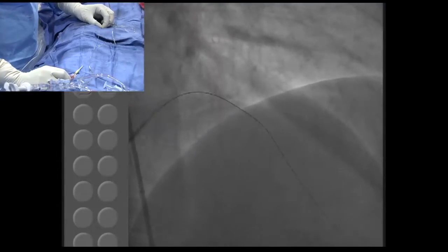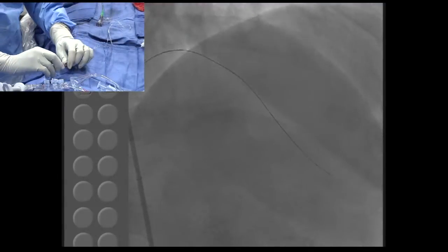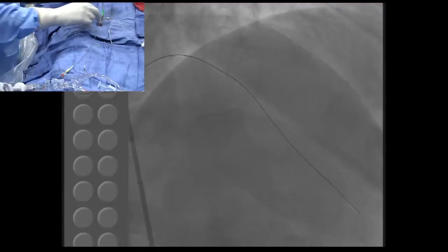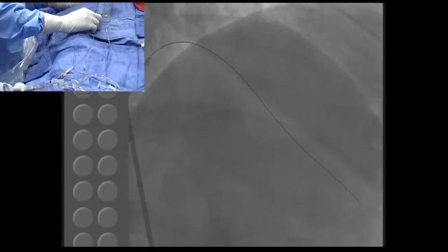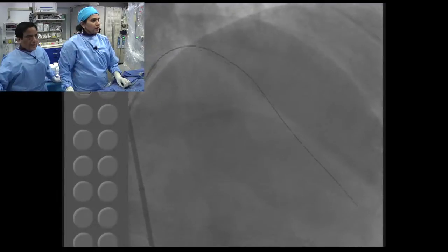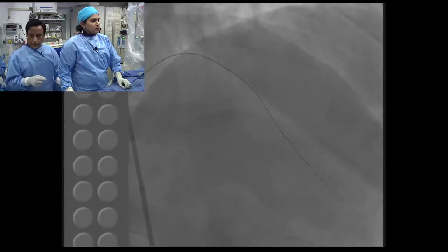Anu, I was thinking that you would probably use a smaller balloon to start with. No. That is just to anchor it. Okay, anchor, yeah. You cannot do a deep extension because the tip of the wire will go and cause perforation. So you just basically anchor in the guide so you can take out your Fine Cross and use a small balloon.